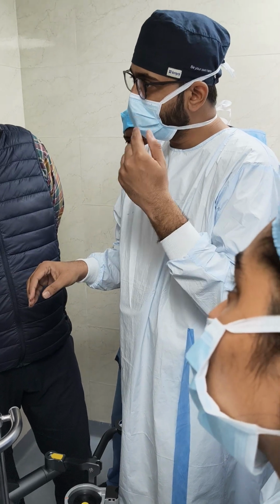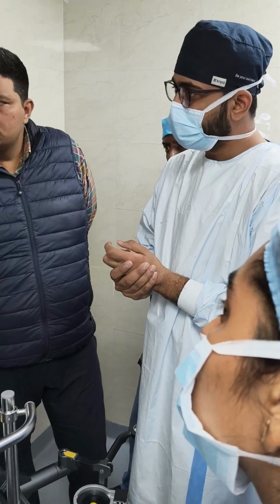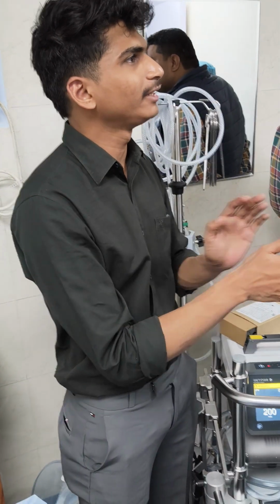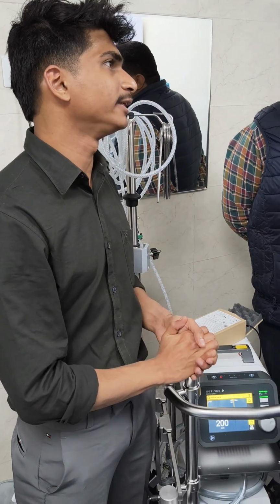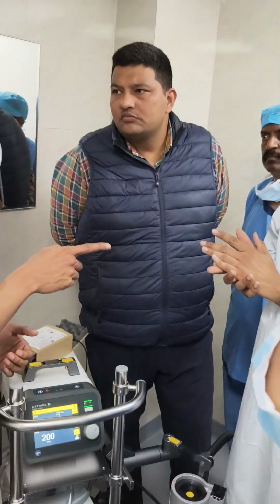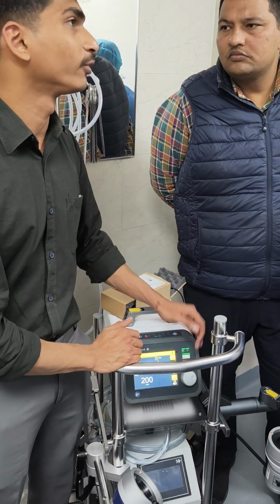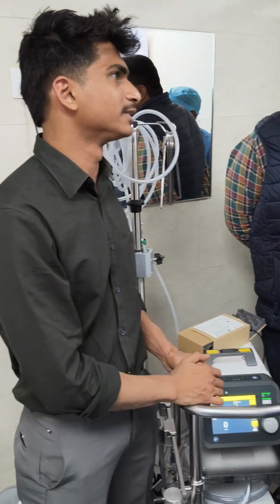Does it act on the liters per minute that I have set, or just on the RPM? No, accordingly the RPM. We are manually adjusting the RPM only. If you set the LPM, like in our heart-lung machine, the RPM will fluctuate according to the preload and afterload. That's what I'm asking. That is the main thing. This is a centrifugal pump, because it mainly depends on preload and afterload sensitivity.